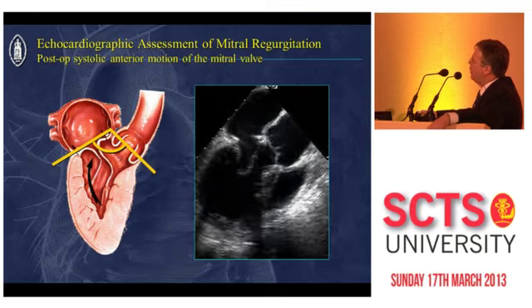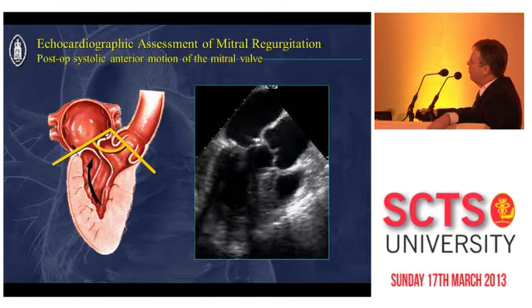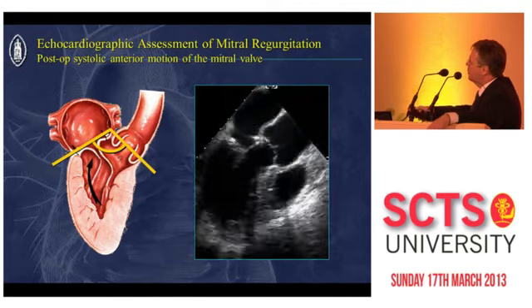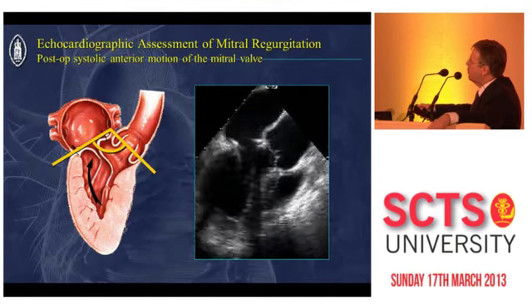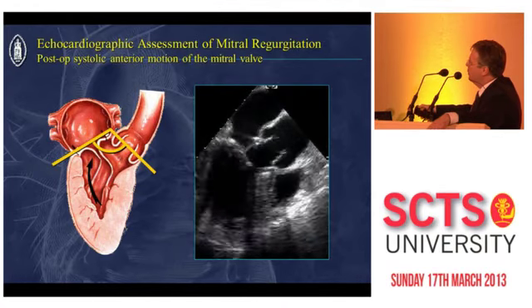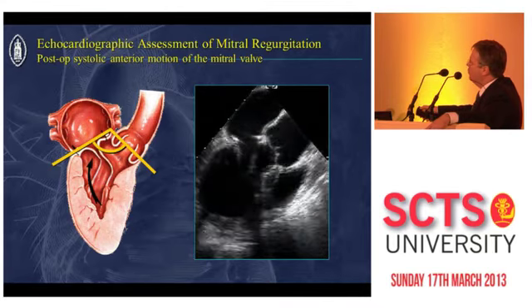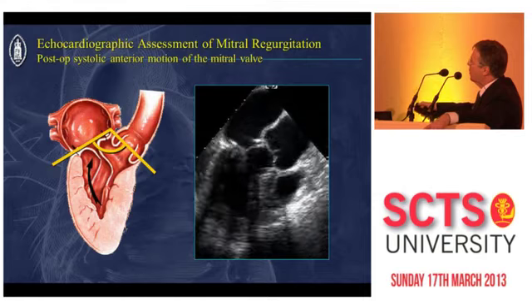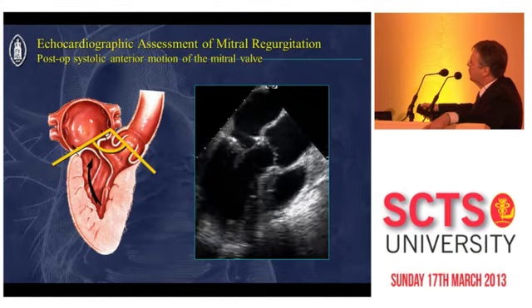You have a patient in whom you see that anterior movement of the mitral valve after weaning from bypass, and you can already see one of the characteristics. This is a very small annulus, so the ring was probably too small. You see that we have a very tall posterior leaflet, so this small ring is bringing that posterior leaflet into the LVOT, and finally we have a narrow mitral aortic angle, which is also pushing the coaptation into the LVOT.